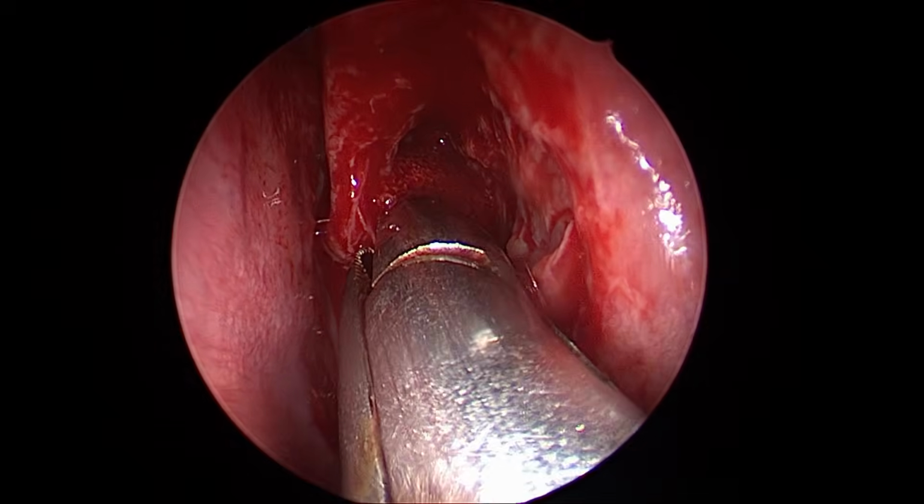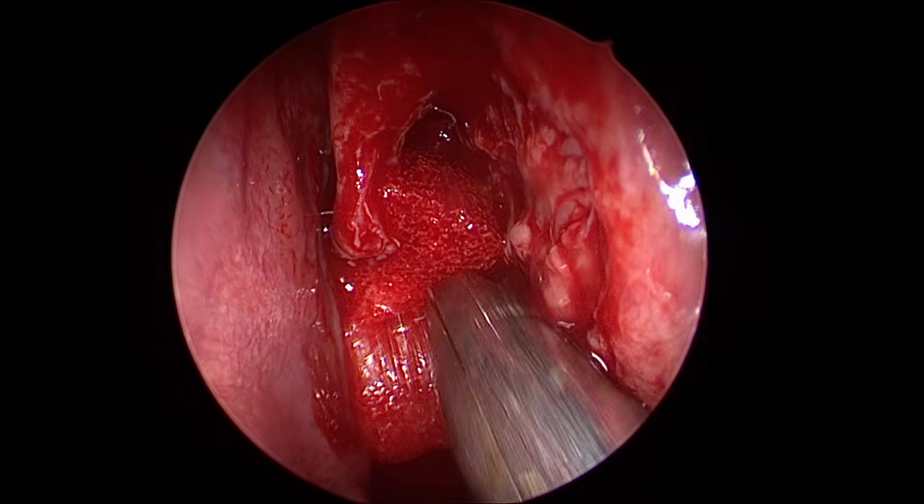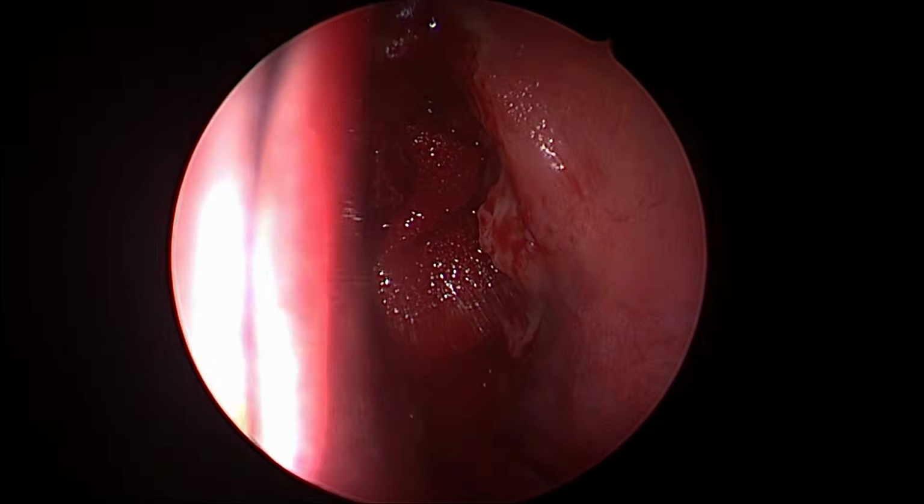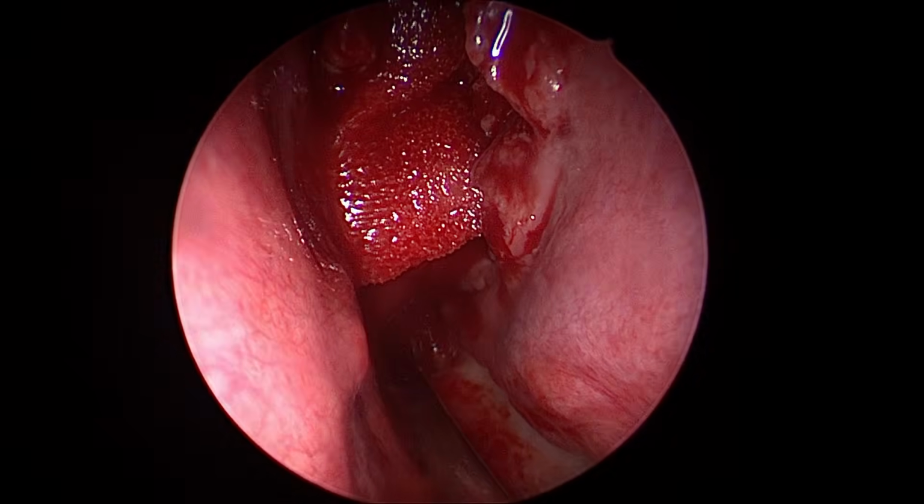We'll start our surgery with a proper uncinectomy now. A proper uncinectomy was not done earlier and is the biggest cause of problem now.